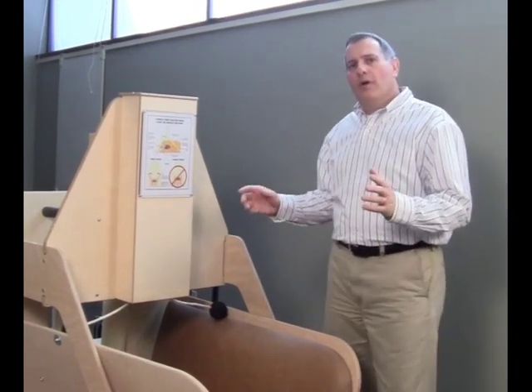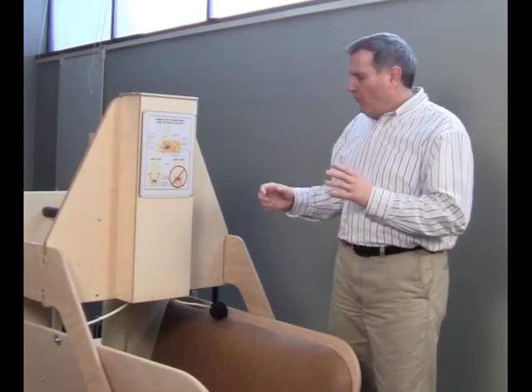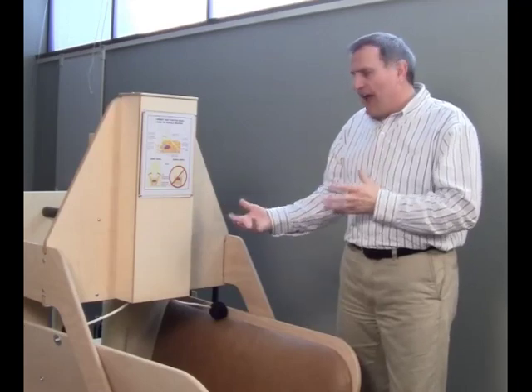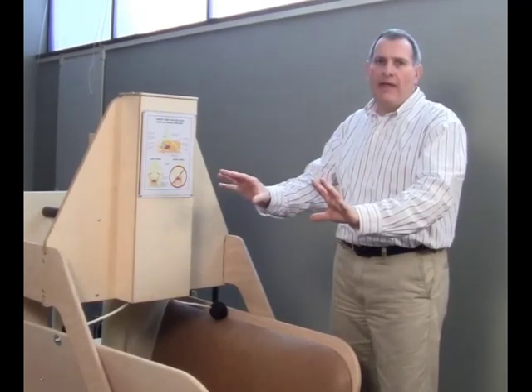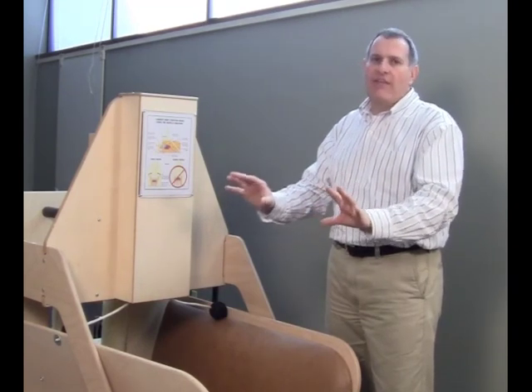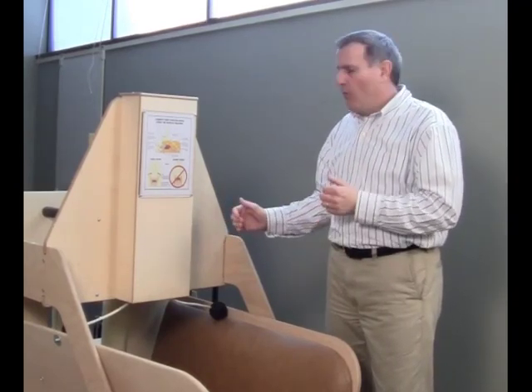You'll find people who are tactilely defensive, so they don't want to be hugged at all, actually use the machine, as well as people who crave that deep pressure. When someone is tactilely defensive and doesn't want people to hug them, this machine gives them the benefit of being in control. Really, the part of the tactile defensiveness that comes about from them pushing people away is because they're not in control of that hug. What the squeeze machine does is allow them to be in total control. So when they pull, it squeezes. When they let go, it lets go.